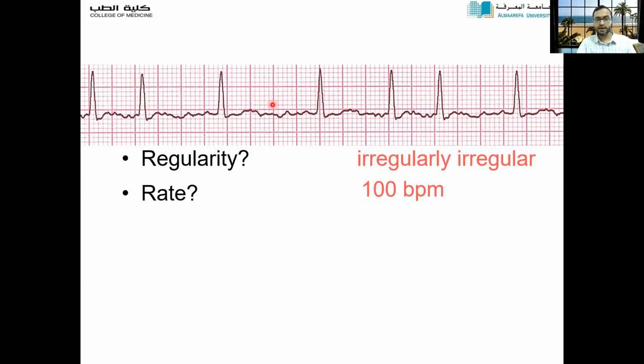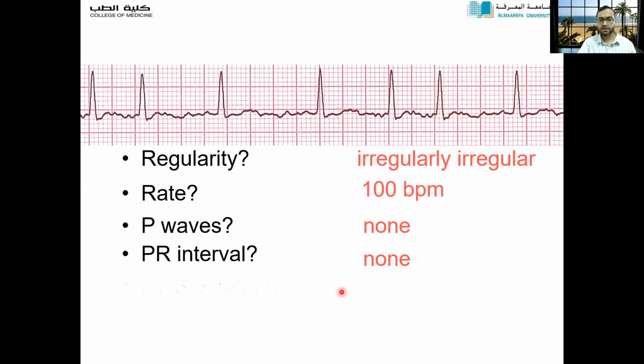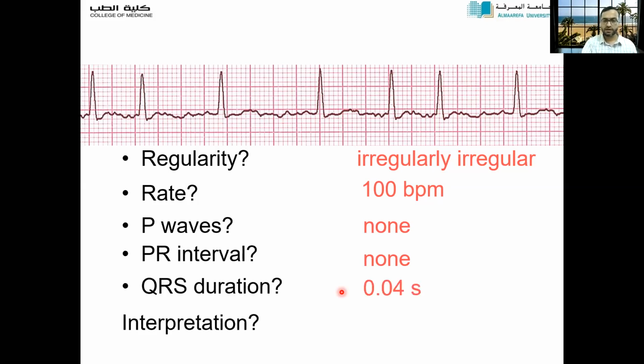So again, same as before, we can see atrial depolarization waves are there, but not P waves. And these are very small, just like vibrations going on, which are known as fibrillation waves. When you count these fibrillation waves, you will see that the atrial rate is going above 350 beats per minute. When the atrial rate goes above 350 beats per minute, P waves are absent and there is an irregular rhythm. This is a diagnosis of atrial fibrillation, not flutter. This is fibrillation.